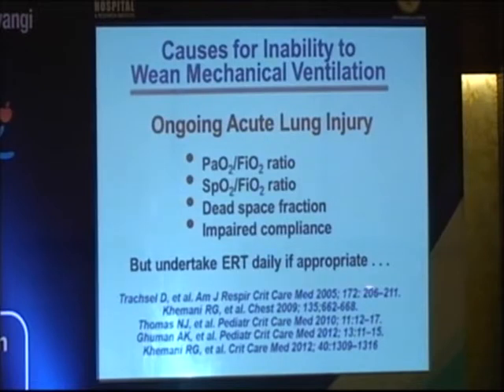you should have a standard work in your unit to daily undertake an extubation readiness test. And this may mean that the patient has to be on less than 50% oxygen, and the PEEP has to be less than whatever number, 8 or 5, something like that. But for the patients where this is appropriate, try them off the ventilator. Try them on a spontaneous breathing trial, because you will be surprised. Some of these patients will be ready to extubate even when you didn't expect it.